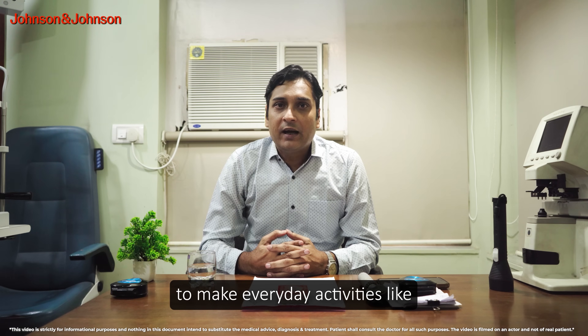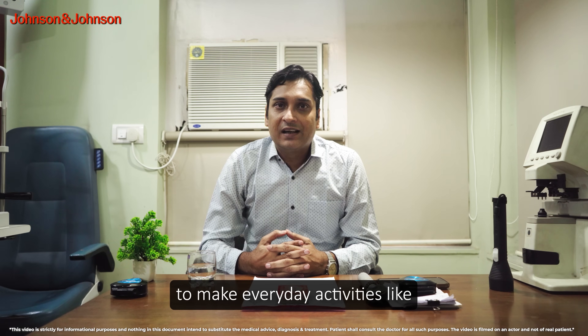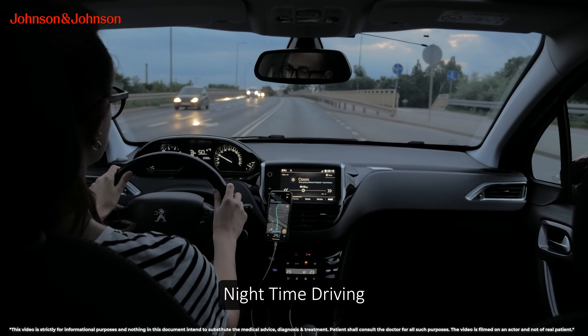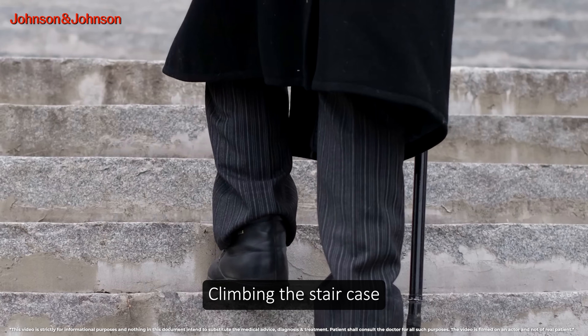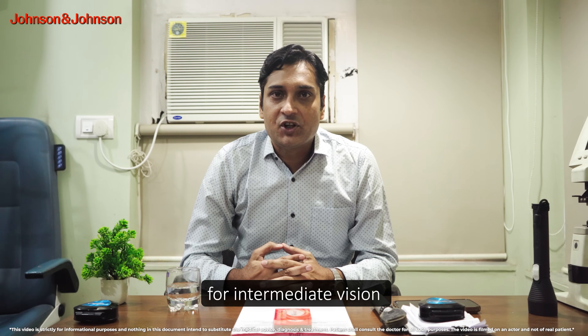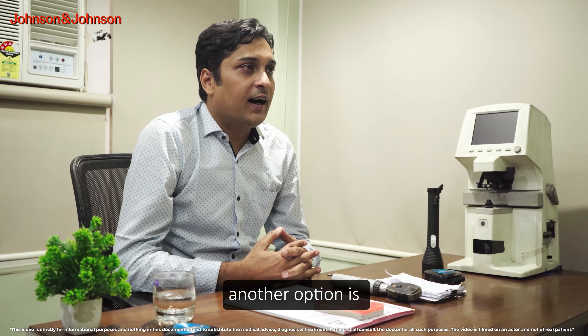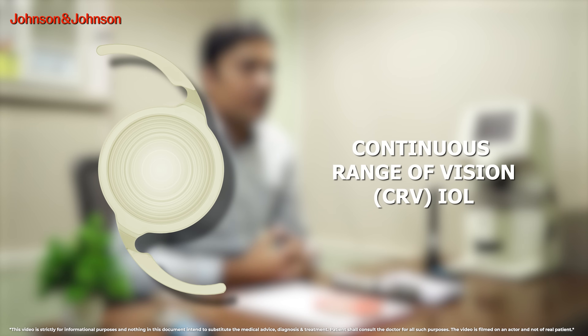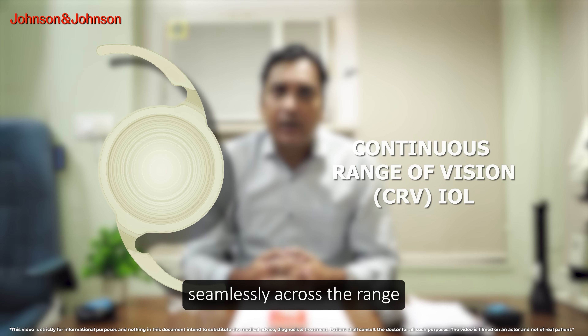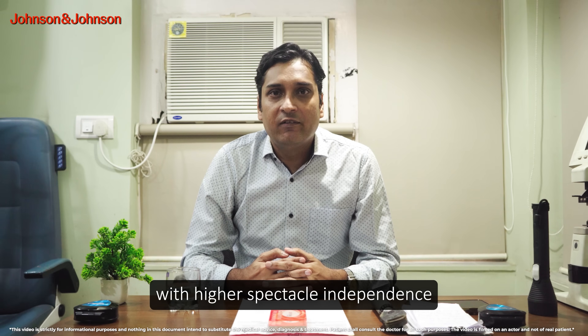Monofocal plus IOLs make everyday activities like shaving, cooking, nighttime driving, and climbing staircases easier, with reduced dependency on glasses for intermediate vision. Another option is the continuous range of vision IOL, which allows you to see seamlessly across a range with higher spectacle independence.